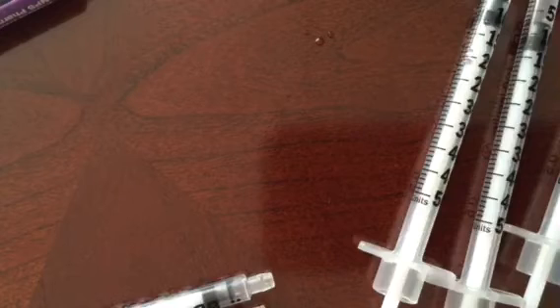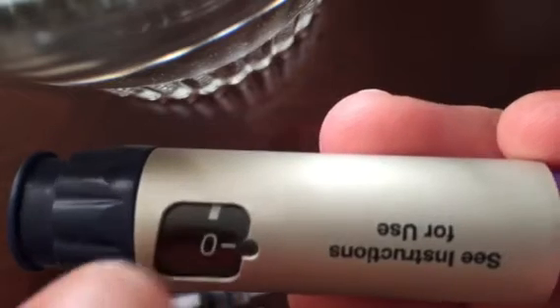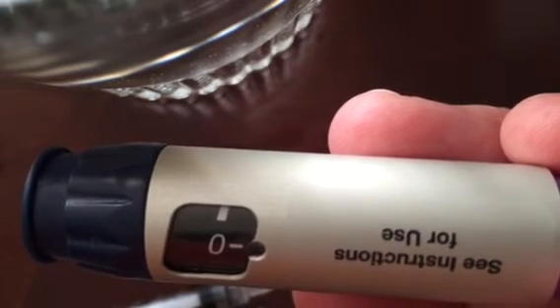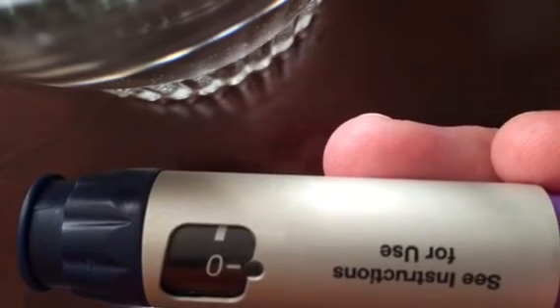If it does, then the next thing I'm going to do is figure out consistently how much drug the pen delivers with each click. I'll have to fill the cartridge back up with fluid, but if you turn the knob, the clicker turns 9 times. And so I want to know consistently how much drug is at 1 click. If it's consistent, 1 click delivers X amount of drug, 2 clicks, so much drug, so that if I want a split dose, if I do 4 clicks, I know I'm getting the same amount every day in the morning, and then 5 clicks, I know I'm getting the same amount every day.